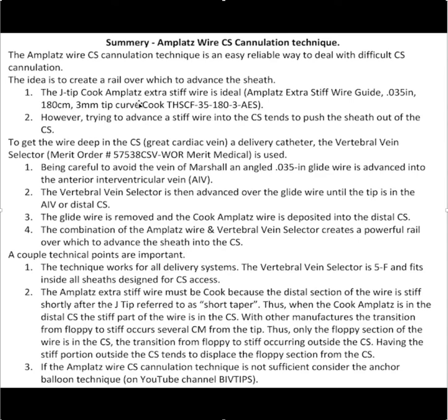You need the J-Tip Cook Amplatz wire, but it tends to push things out of the coronary sinus, so you need a conduit to get it in. For that purpose, use the Merritt vein selector because it's braided and has pushability. Be careful that the glide wire doesn't go into the vein of Marshall. Once you get the glide wire deep in the CS, advance the vein selector, take the glide wire out, and put the Cook in.